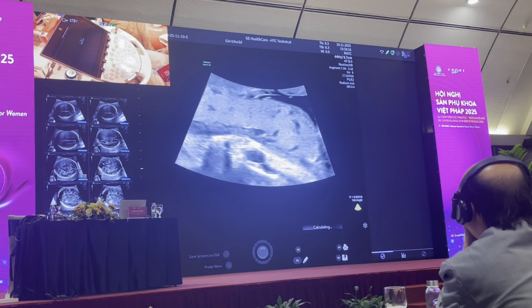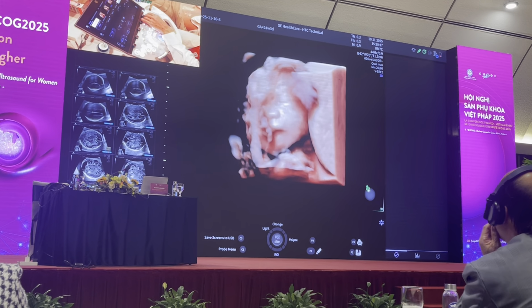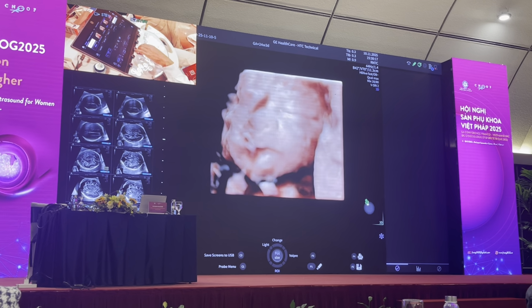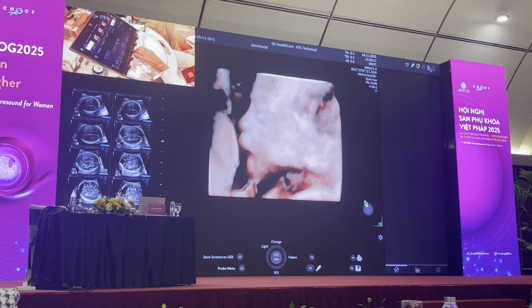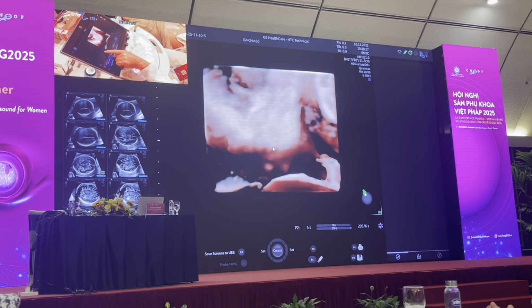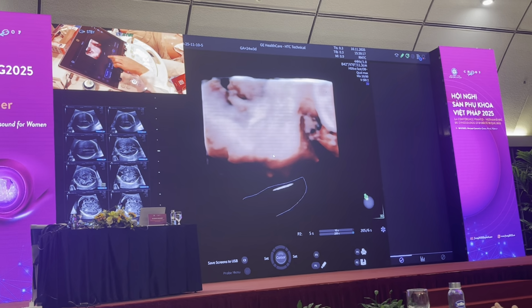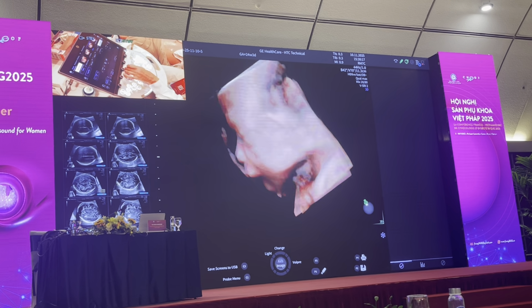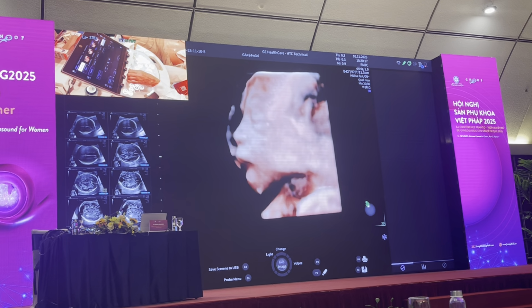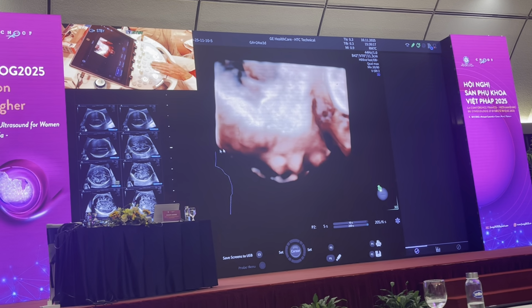It's very mild. And I look at this rendered image, coming up, insert this rendered image. I rotate around the z-axis, increase my angle, rotate around the y-axis, and I see a very minor degree. In terms of getting the echoes out of view, the magic cut, take these echoes out. And you can see that there's a mild degree of micrognathia. In terms of getting the other echoes out of view, again, I'm just going to leave it as well.